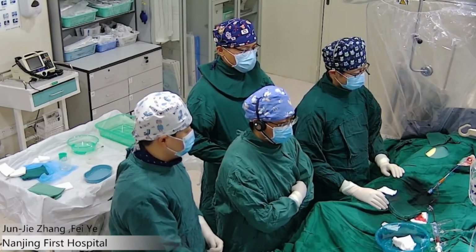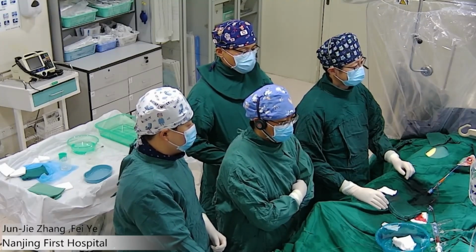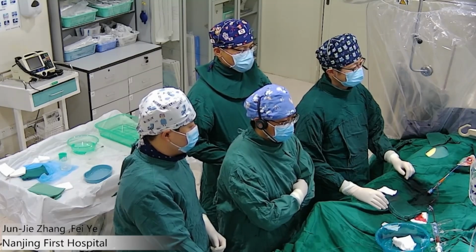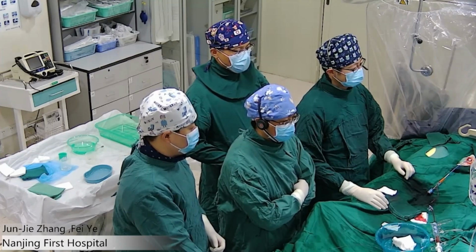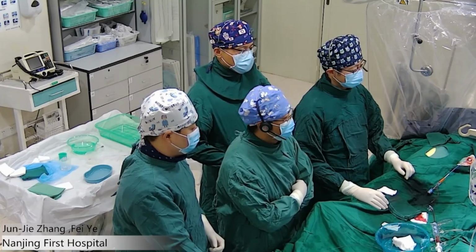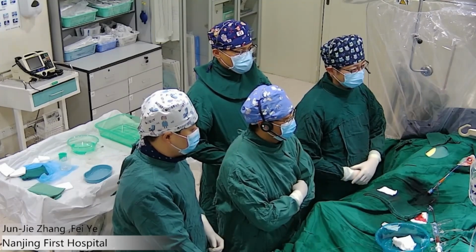This is a live demonstration from Nanjing First Hospital, China. I'm Dr. Junjie Zhang. Today, in the next 2 hours, there will be 2 live demonstrations from our CAS lab. All are left main bifurcation lesions with severe calcification. This is CAS lab 4. Let me introduce the first case.